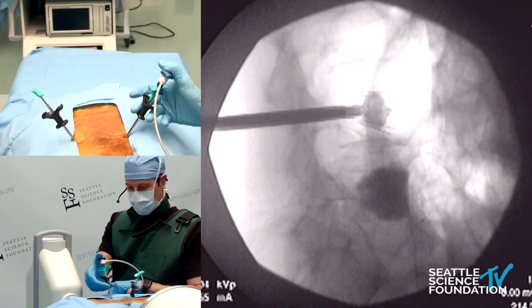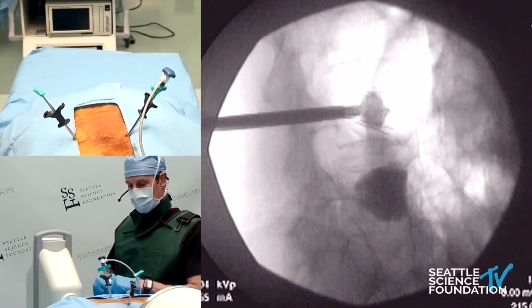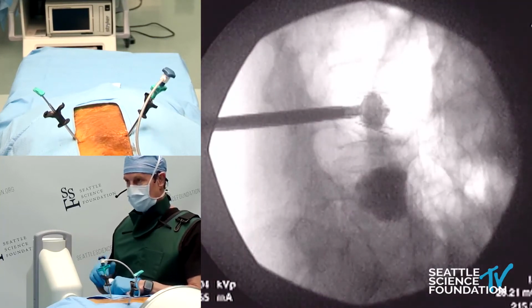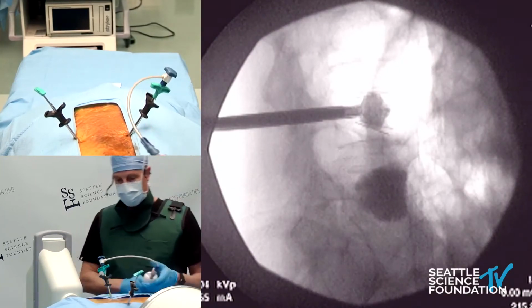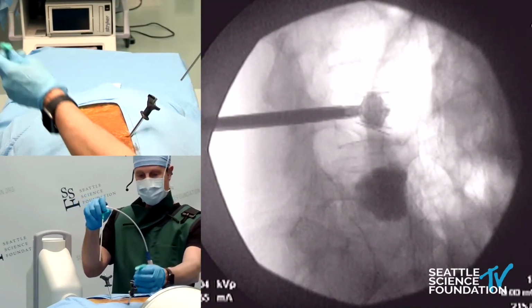And put the collar, press the collar so it holds on. And then after it goes up and down the jack, typically it will meet in the middle. So I'll put some cement here, put some on the other side.